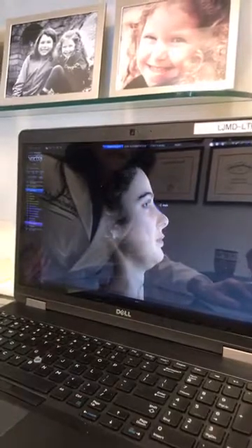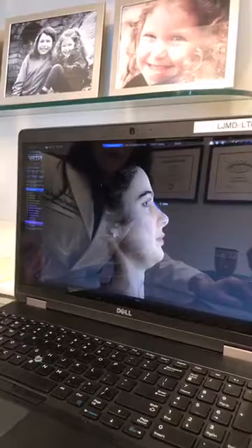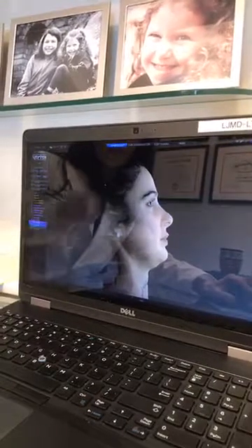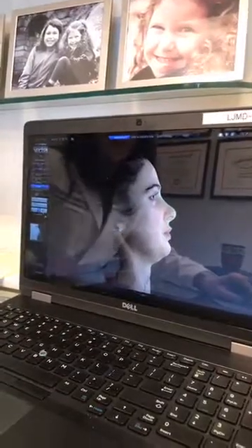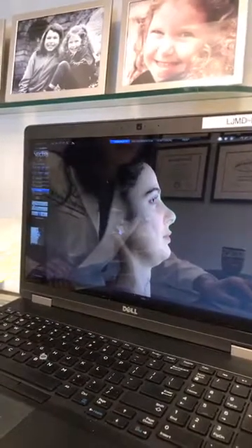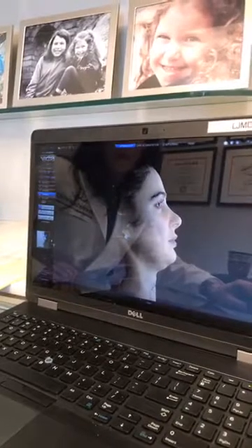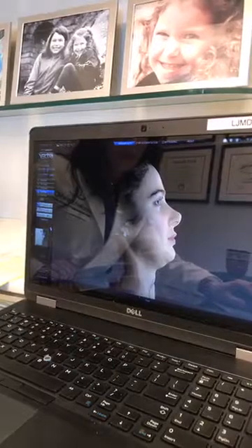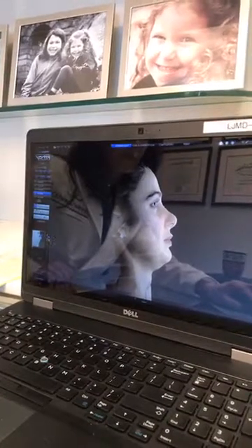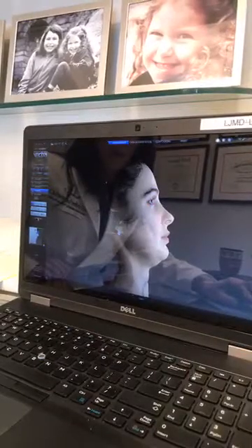But again, if we look at the dorsal height, we can see that she's a little low here and a little too high here. So then we go to the fun part of this program, which is going to let us see what kind of simulation we could do, which is always really fun. So here's a simulation of what we can do to the dorsum. We can make her nose either really, really pointy like Pinocchio, or bring it down much lower.